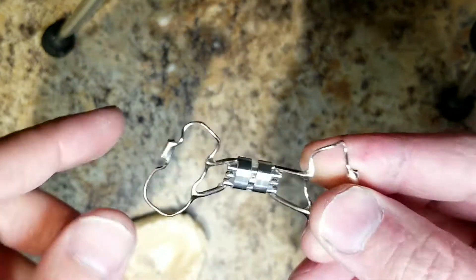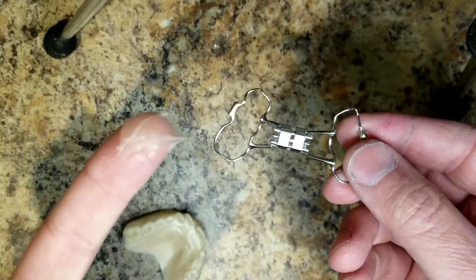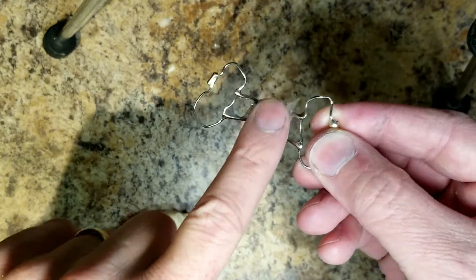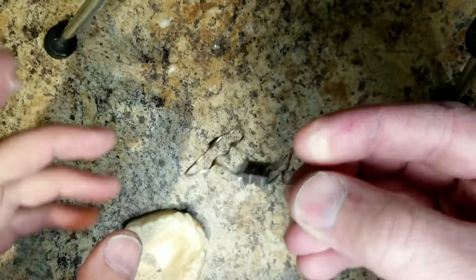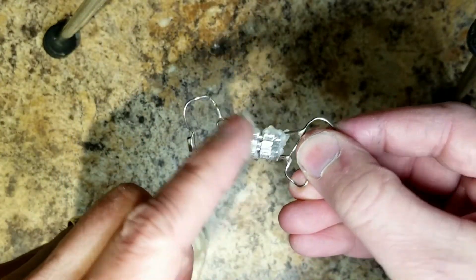So here's the really simple trick: you're going to grab some Vaseline and you're going to bury the screw in Vaseline, just like this — bury the spindles.